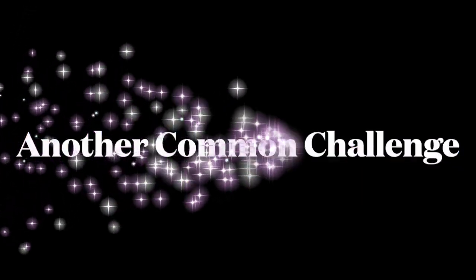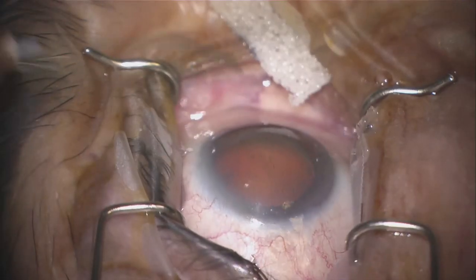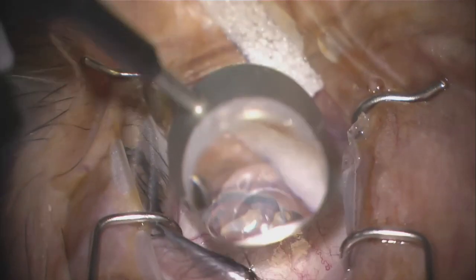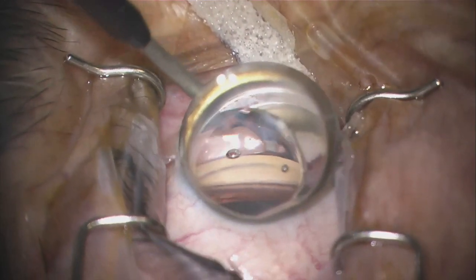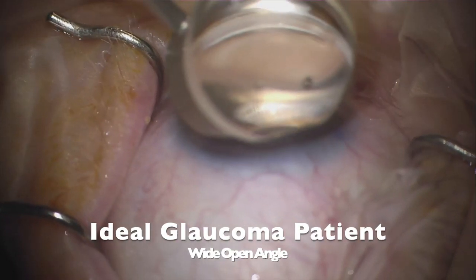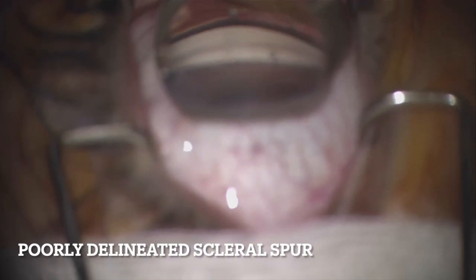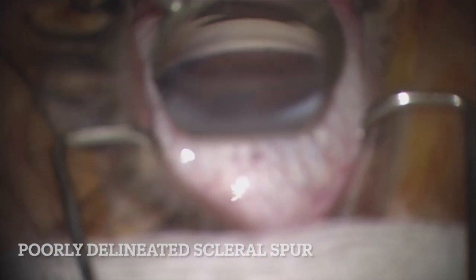Another common challenge is having trouble identifying the angle anatomy structures. This has to do with preoperative selection. Mastering clinical gonioscopy skills will help you feel more comfortable with angle anatomy, followed by practice using the gonio prism in the OR. I suggest for starters to choose patients who have wide open angle anatomy where the scleral spur is clearly delineated. This will allow for excellent visualization of the catheter behind the TM in Schlemm's canal, both during viscodilation and trabeculotomy or the unroofing of the TM. I tend to avoid patients whose anatomy is borderline open with heavy ciliary body bands or poorly delineated scleral spur.